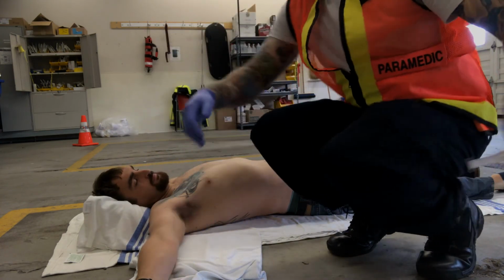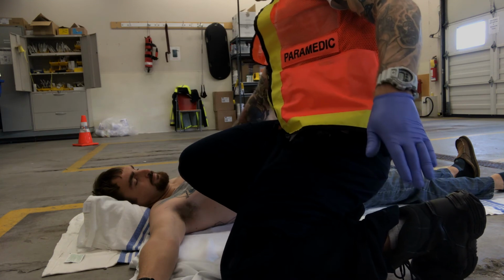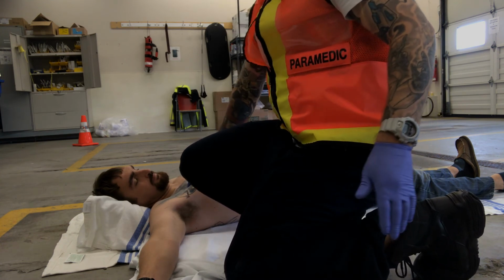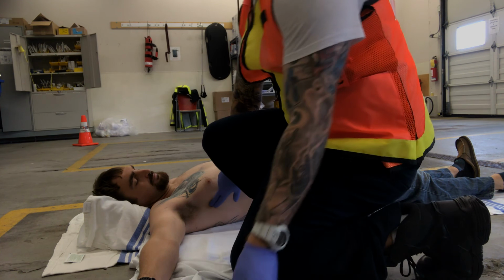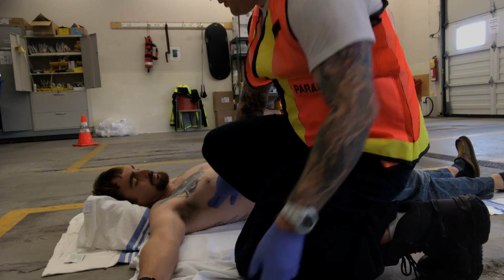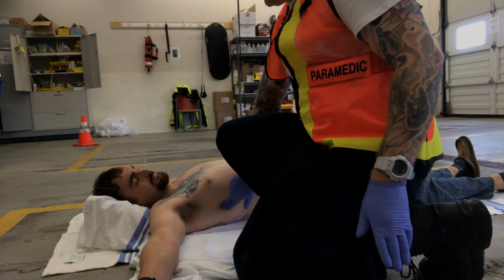In the event that I was unable to access this site, I'm going to landmark the 4th or 5th intercostal space at the mid-axilla. Again, 2nd intercostal space, 3rd, 4th, follow that around to the mid-axillary line. I'm going to follow the same procedure, making sure to go on top of the rib, not below it. I can also do this at the 5th intercostal space.